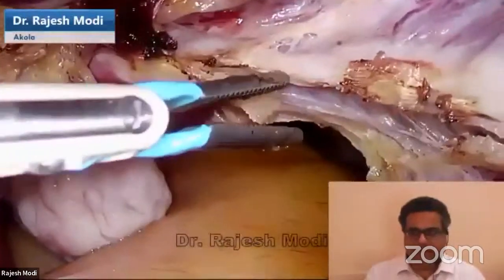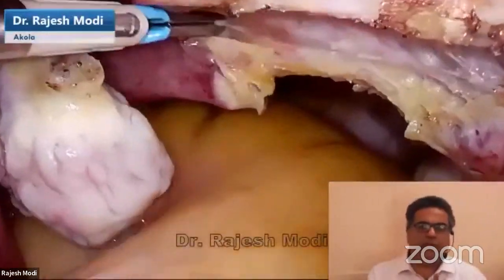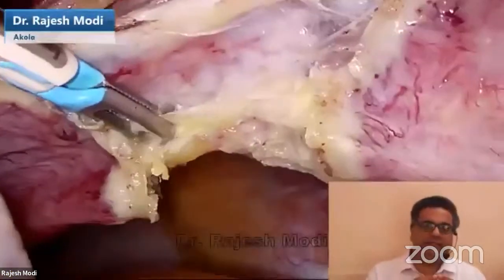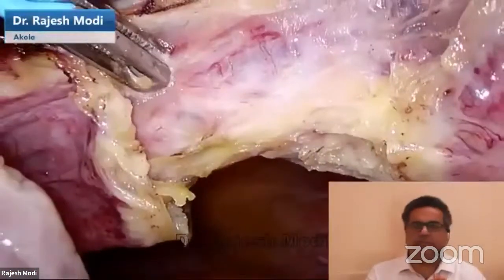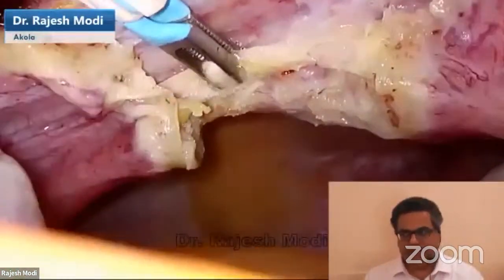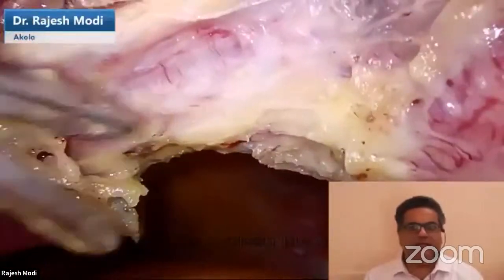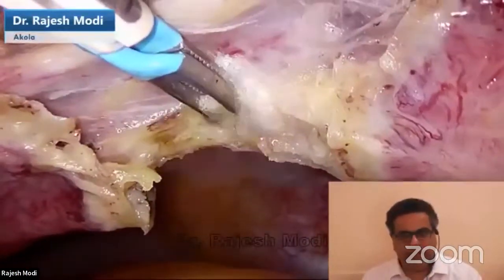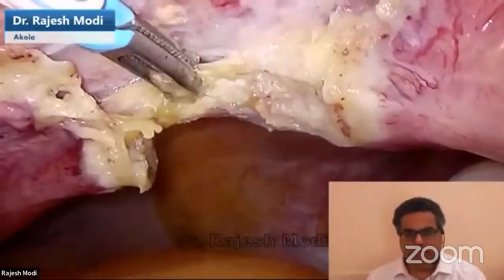Again, I would like to reiterate, there is no need to coagulate or cauterize this particular portion. But in case there is any bleeding or oozing from the uterine which you have released, then you have a good segment which can be held, pulled medially, and then cauterized. So this step of skeletonizing the uterine helps you to prevent any ureteric injury in a hysterectomy.